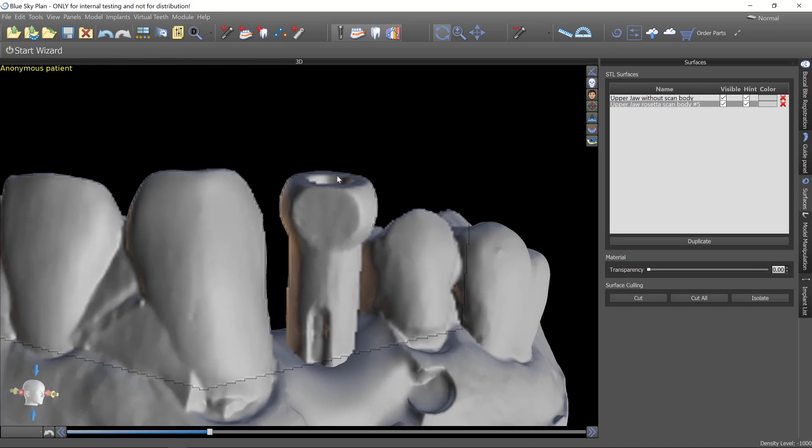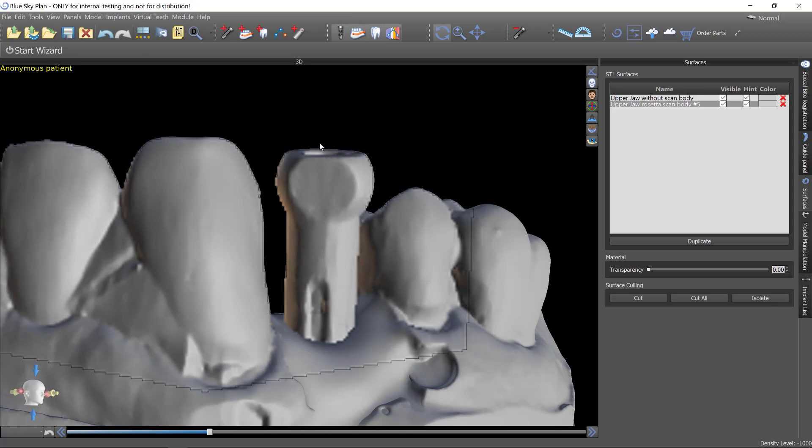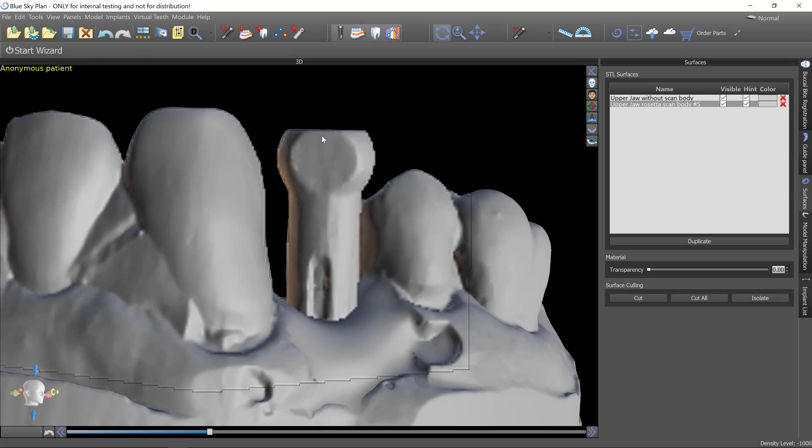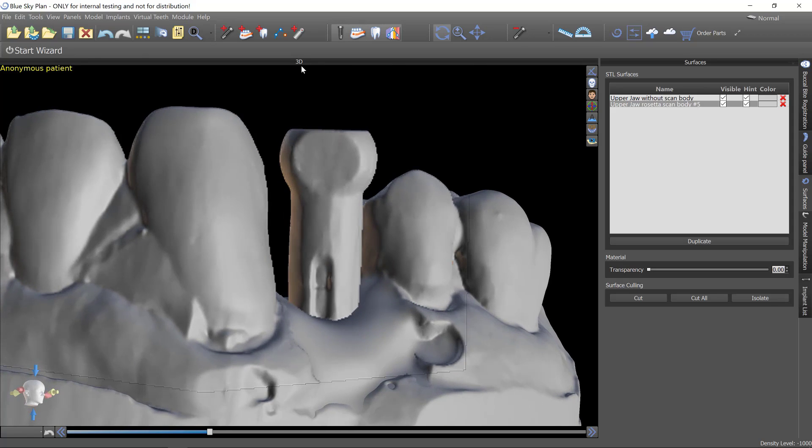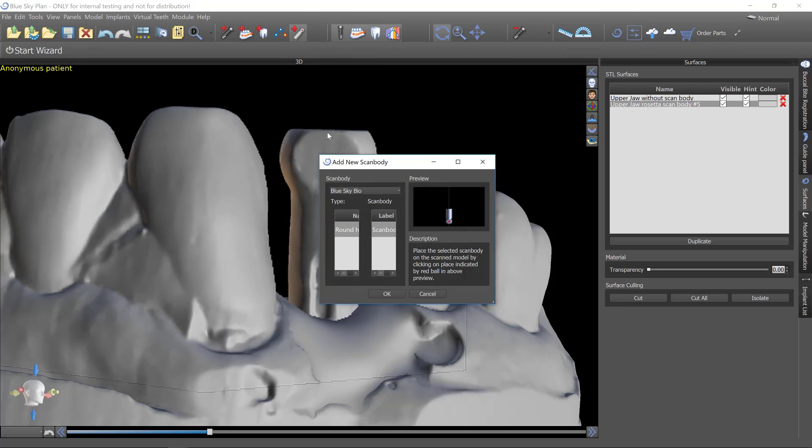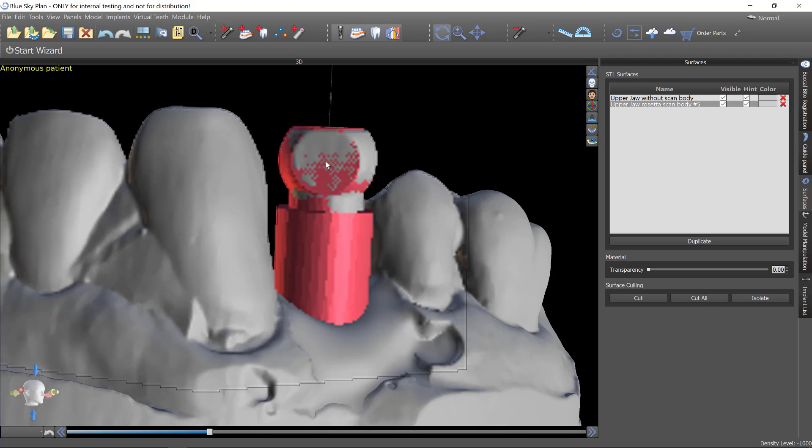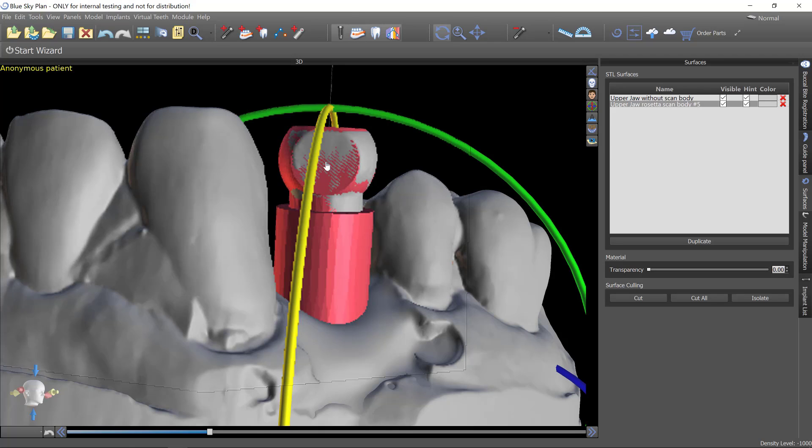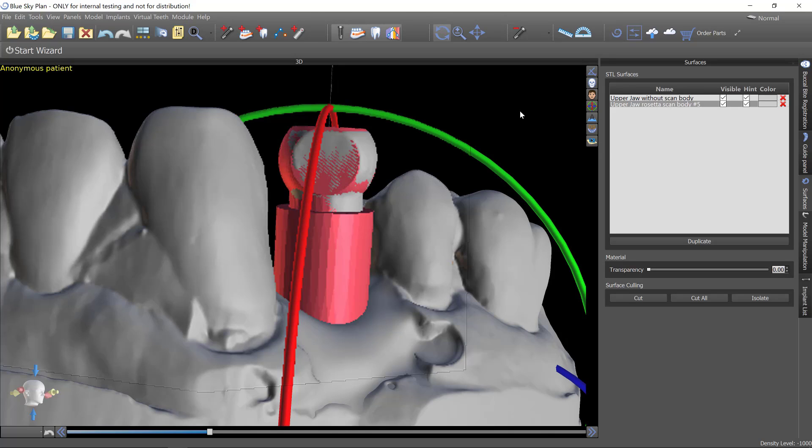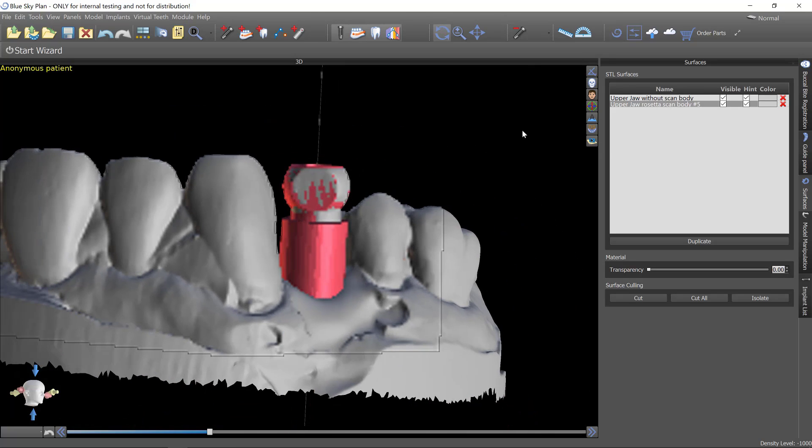I'm going to orient this to where I'm looking straight on at the ball. And I'm going to go up and add scan body. There's only one scan body choice in the software right now. So this is something that will expand the library over time. But all I have to do is put a single click right in the middle of this circular face and it will bring in the scan body.